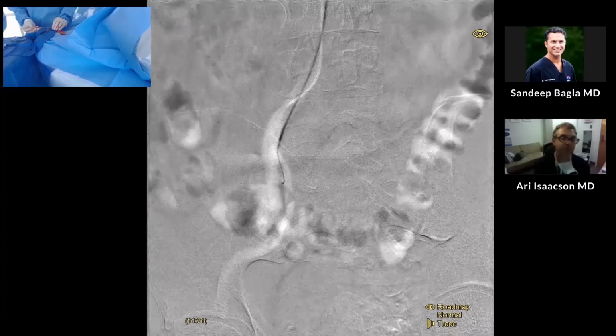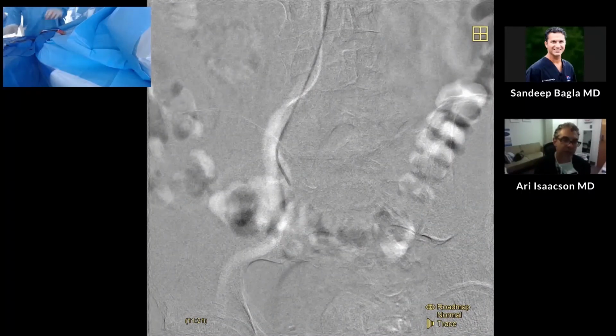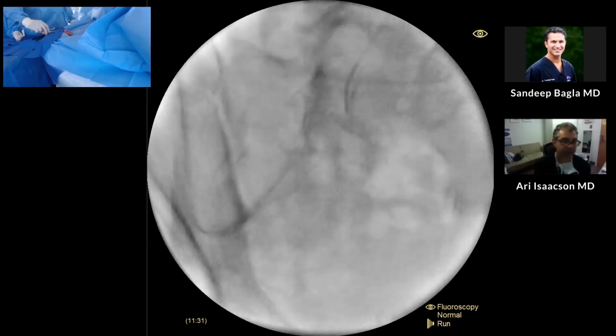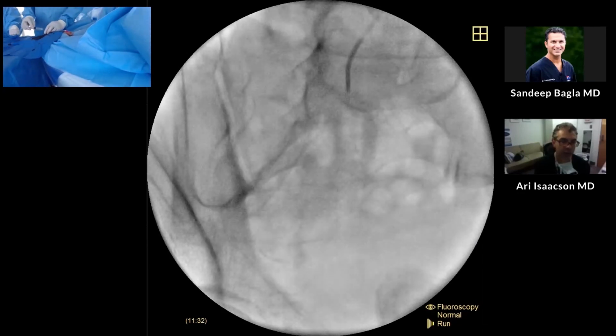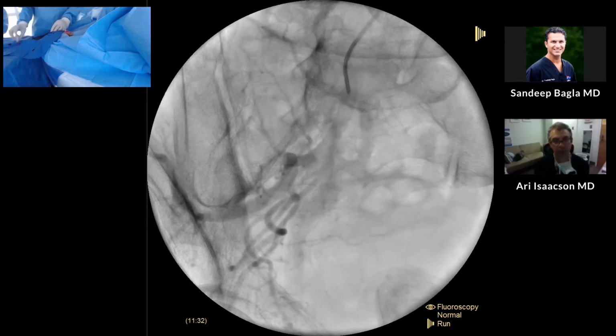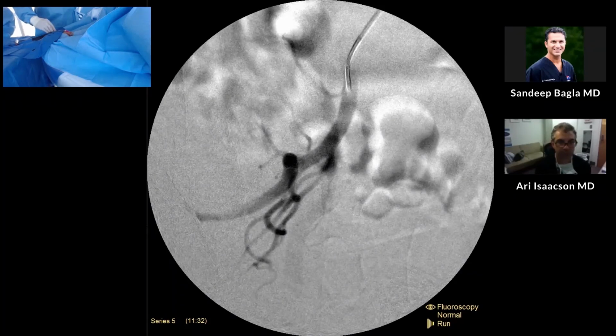That's great. I think you're limited a little bit, right? Because as far as the length of catheter that you need from a radial approach, there are not a lot of catheters at a 125 length, at least not in our inventory here at the hospital. So I rely a lot on wires, and I really like a shapeable glide wire, so I can put a custom shape in there to get me into a tough hypogastric origin. Okay, so you like that for sure. I would agree with you. I think that's probably a nice way to get in.